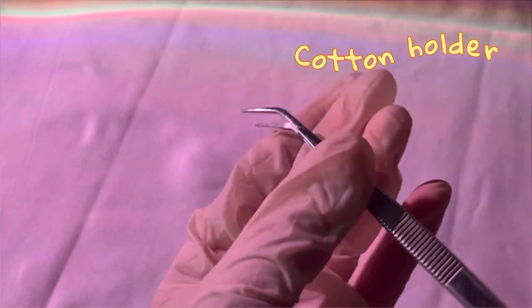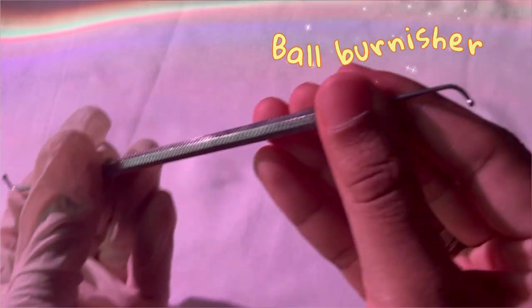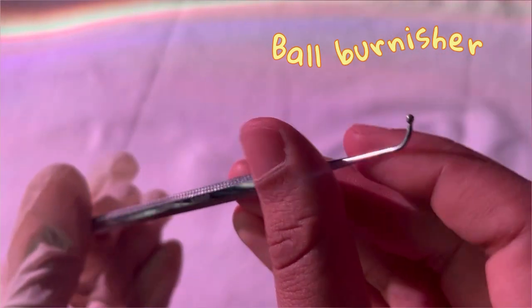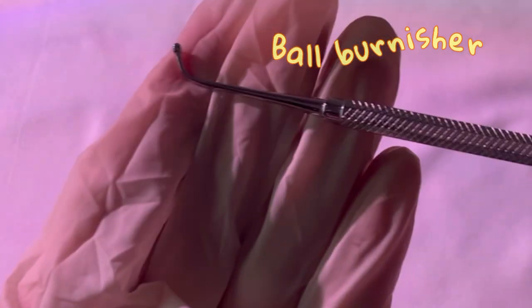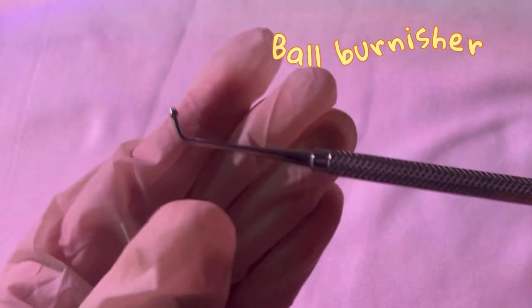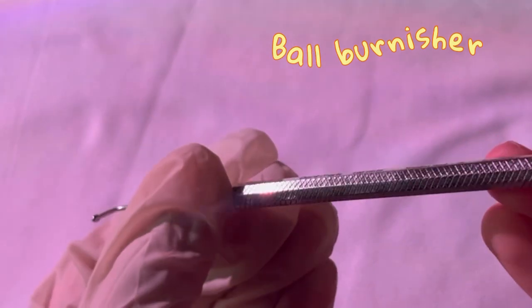Next up we have the ball burnisher. Both sides are the same. The name comes from its appearance because it looks like a ball — so you can remember this very easily. The ball burnisher is used for shaping, contouring, and polishing restorations.